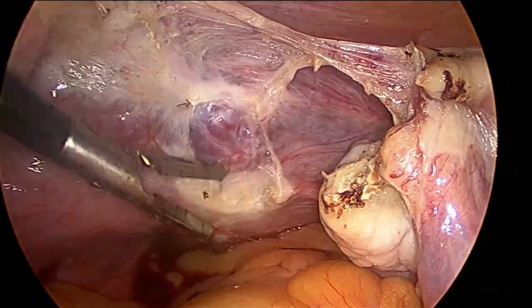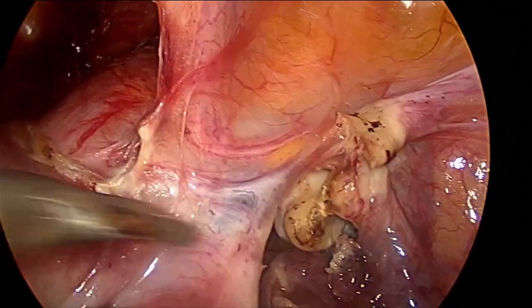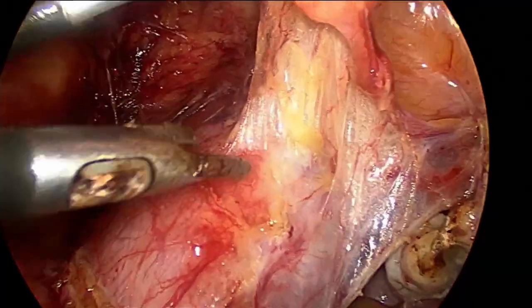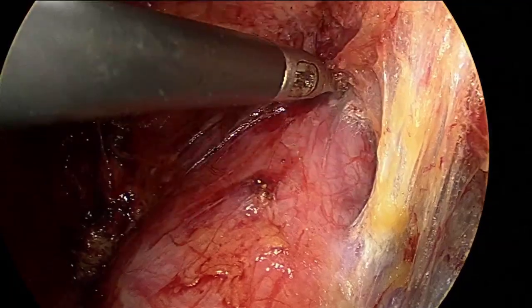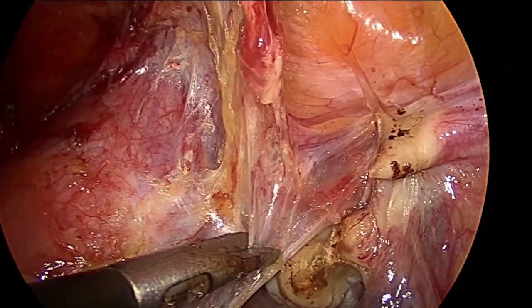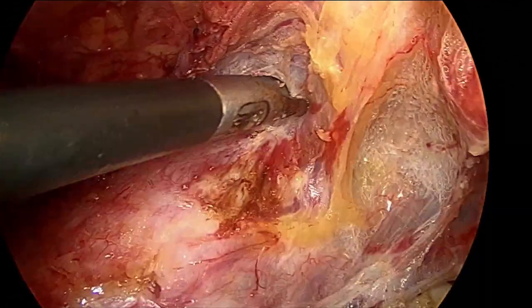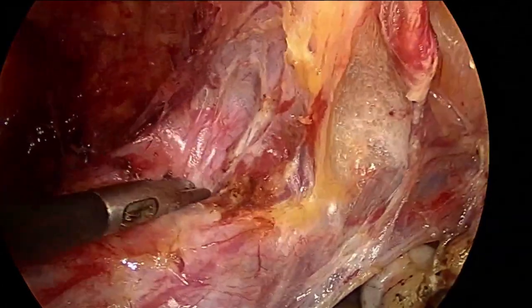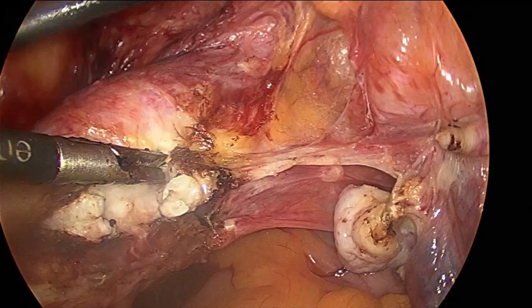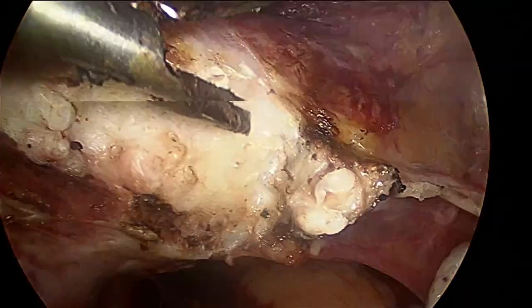Here we can see the venous plexus. The bladder dissection was carried out; the last part of the bladder was dissected deep down from the right side. We should lift the bladder upward so it makes a good plane between the cervix, vagina, and the bladder. After good dissection of the bladder, we proceeded to the right uterine bundle, where the uterine vessels were well coagulated with the ligation current, cut, and then lateralized well deep till the uterosacral ligament.